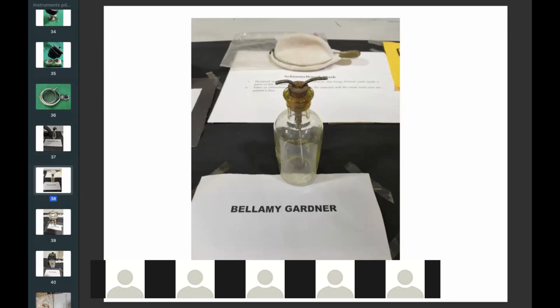I think this is covered with gauze pieces, you can see, or it is inside a plastic bag, I don't know. It is covered with gauze pieces. So you drop ether drop by drop here. After using your ethyl chloride, when the patient goes into a certain phase, you drop it. And once the patient is completely relaxed, you can intubate and put him on.